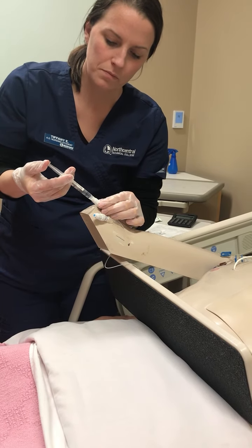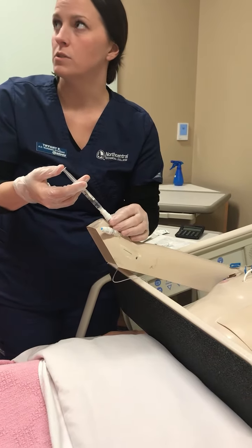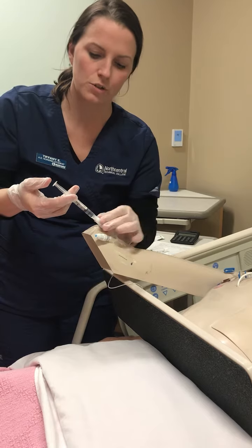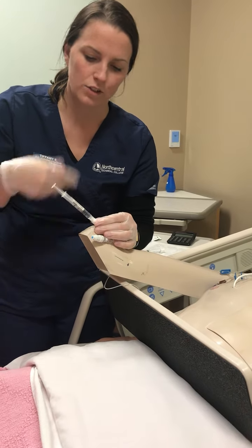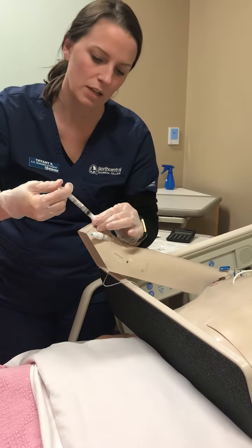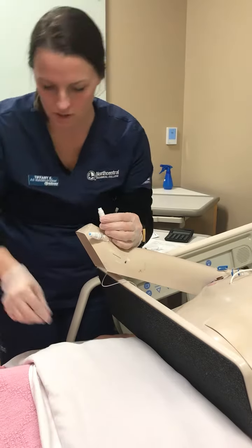So for time's sake, I would use a clock or look at the clock to make sure that I am delivering it over the appropriate rate. Again, there's no dilution needed here. So I'd go ahead and administer this over 2 to 5 minutes. For time's sake, I'm just going to time lapse here. And I'd administer my medication, take that off, and then I would go ahead and clean the site.